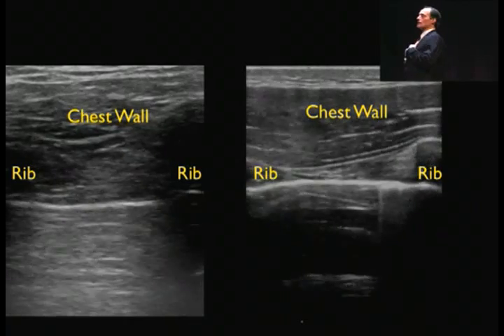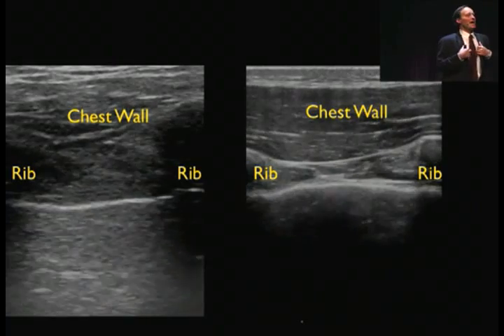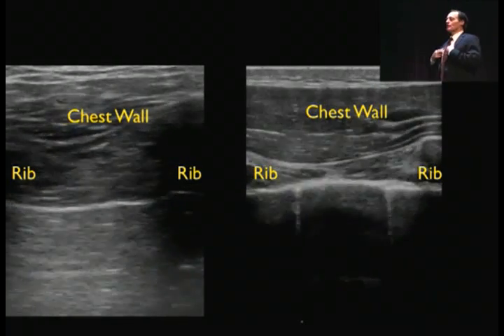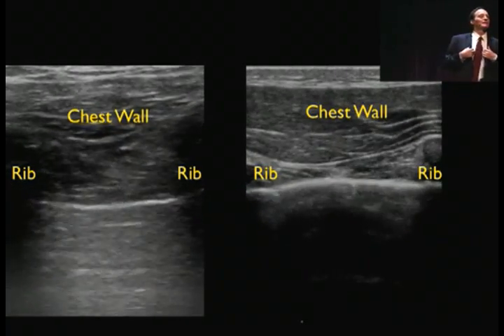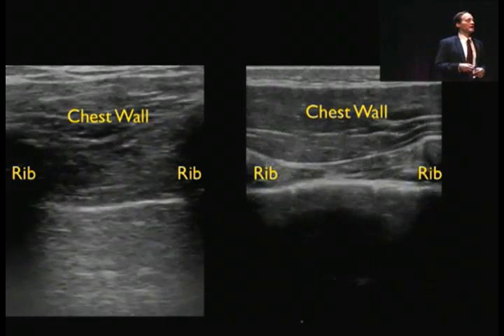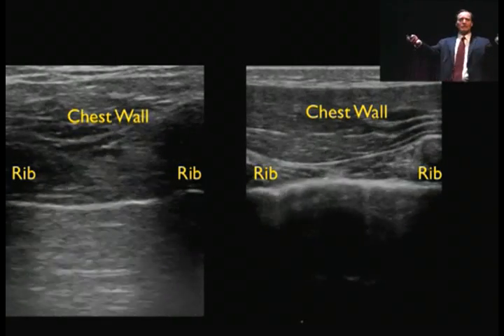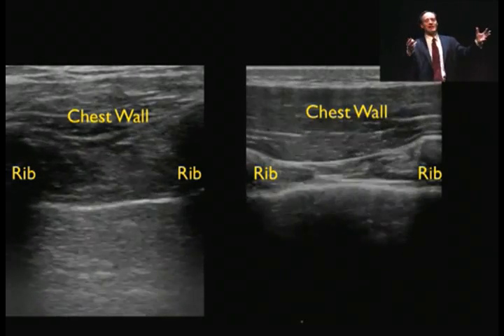Okay, so where's the pneumothorax? Kind of like, where's Waldo? How many say the pneumothorax is on the right side? A couple votes over here. How many say put the chest tube in the left side? Pneumothorax on the left side. You guys are great. So you actually put the chest tube in the right side.